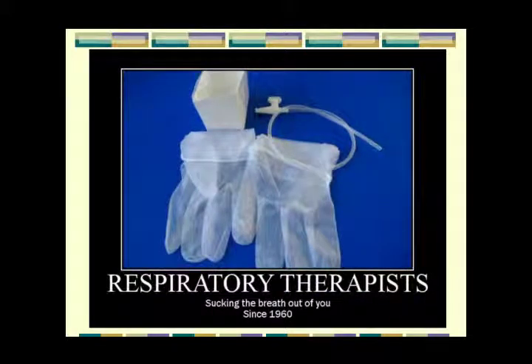Actually, 1960 probably isn't a truthful statement. But here's an example of a suction kit: two gloves, a little canister, and a suction catheter. It's inside of a paper bag, and when you unfold it, it now becomes a sterile field. So we'll show you how to do this in an aseptic method.